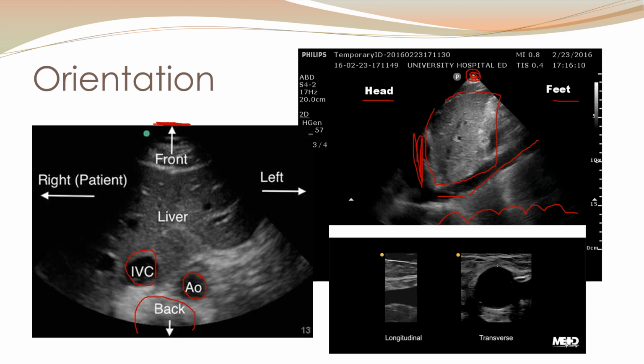And then this is just an example on a nice vessel. On this vessel, you see it's lengthened out, it's long here. Here you see it in transverse. So those are 90-degree images to one another. This is looking at, say, a hose from the side of the hose.